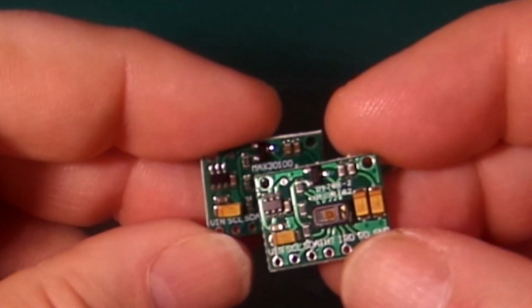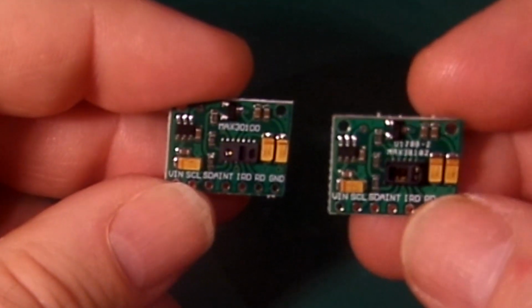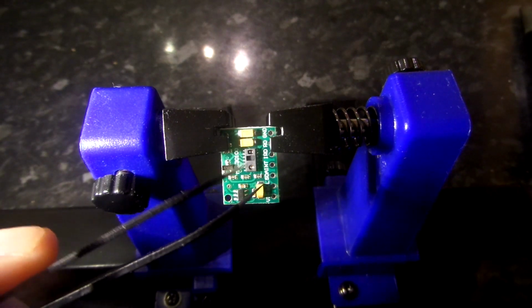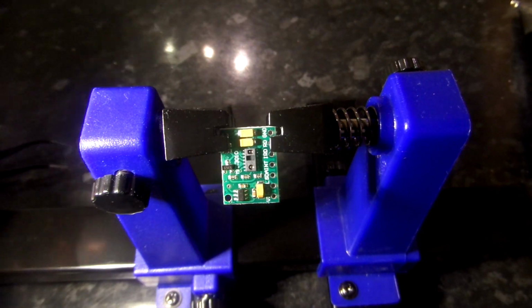I'm basically just going to apply some heat and give it a bit of a poke, and it should just come off. So let's move on, and I'll solder these up and we'll connect them to our Arduino. I've got a bit of solder wick and my handy tweezers to try and pull away. May not need them, we'll see. Let's just have a go. That's a really awkward angle for me.